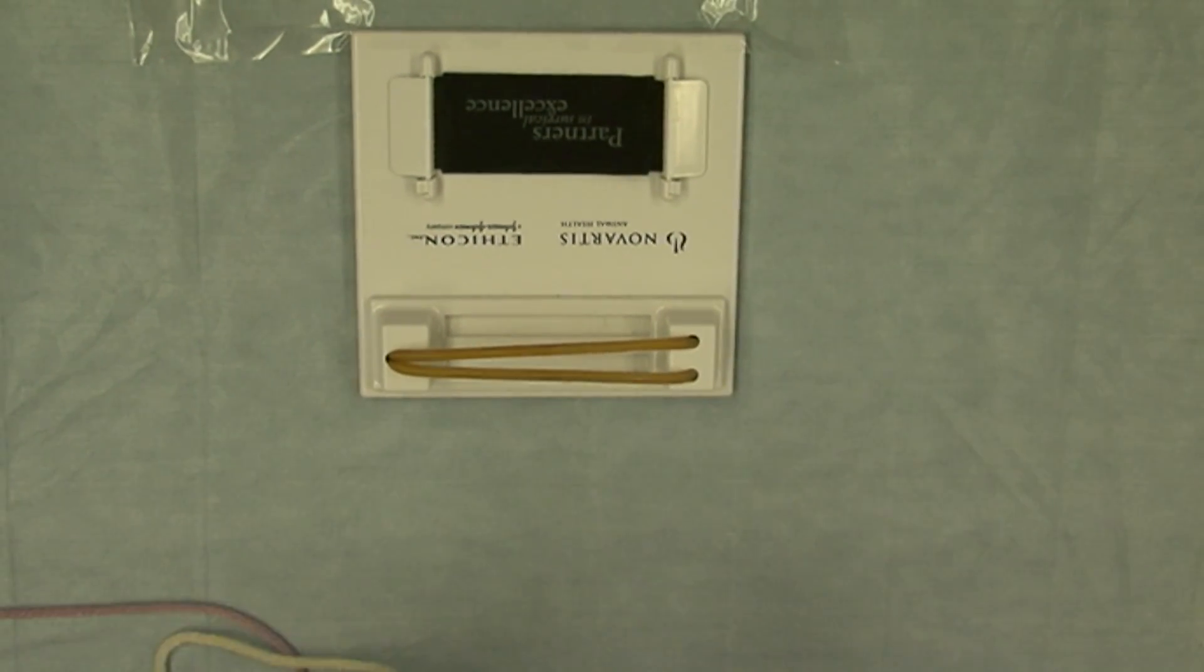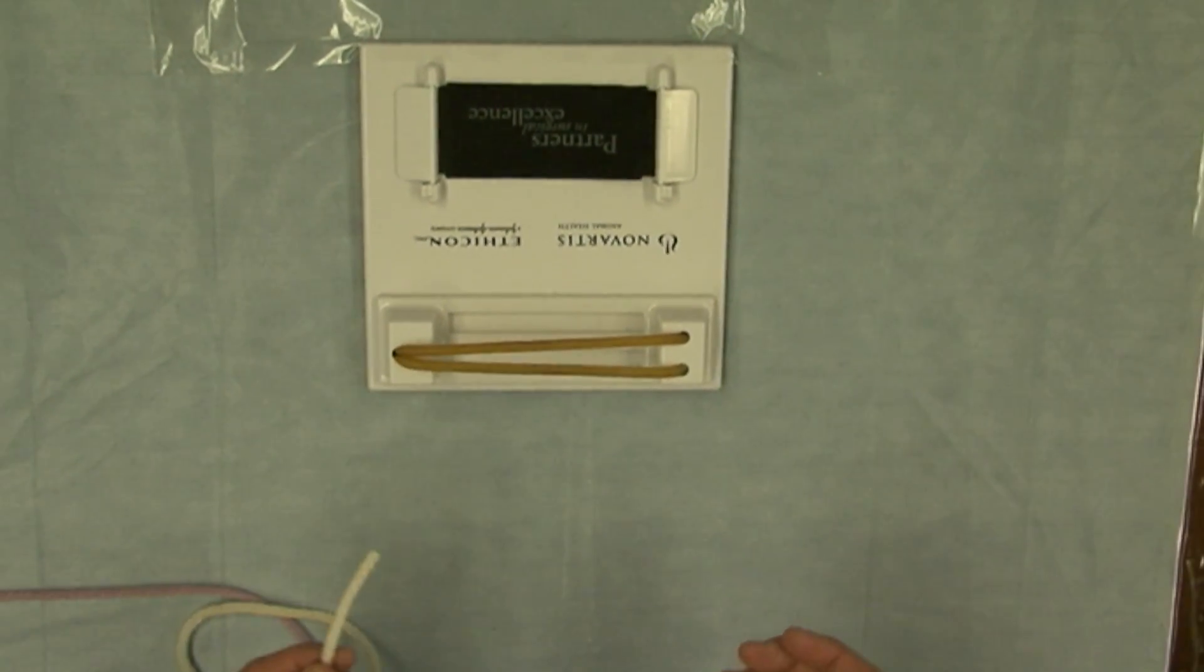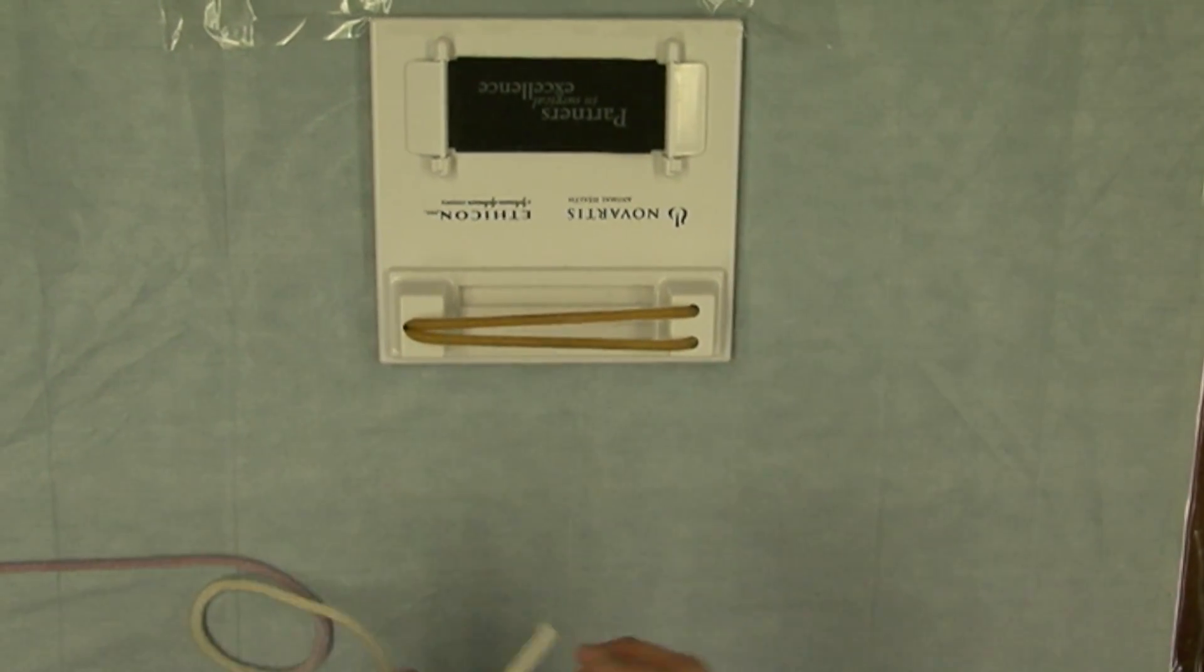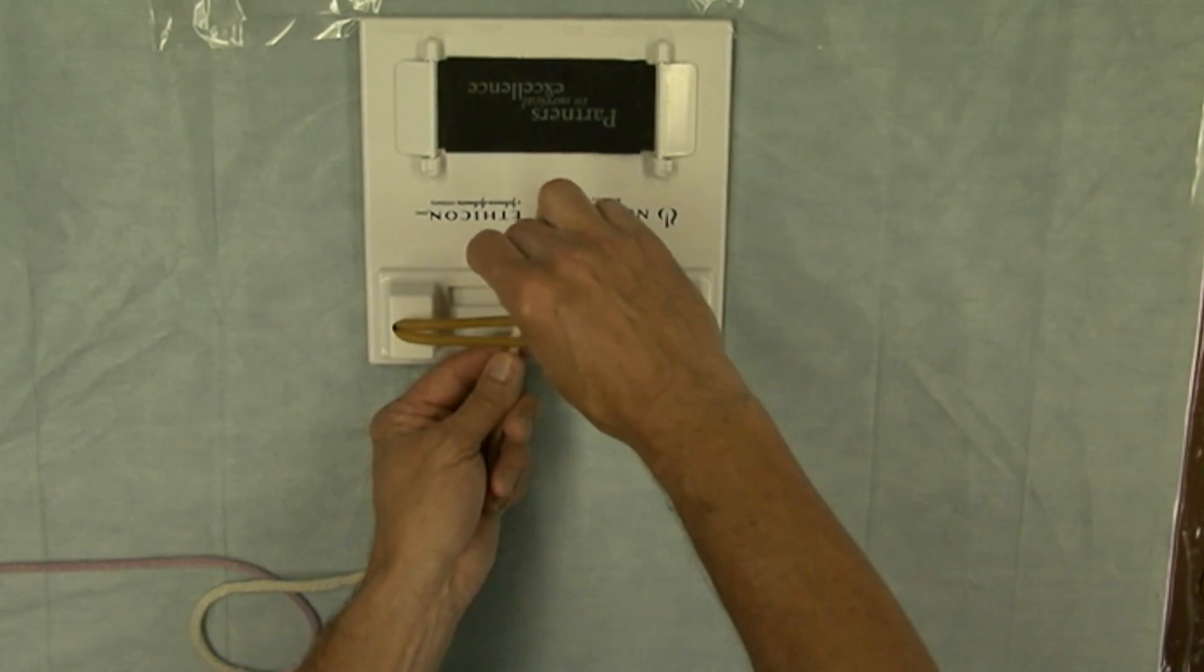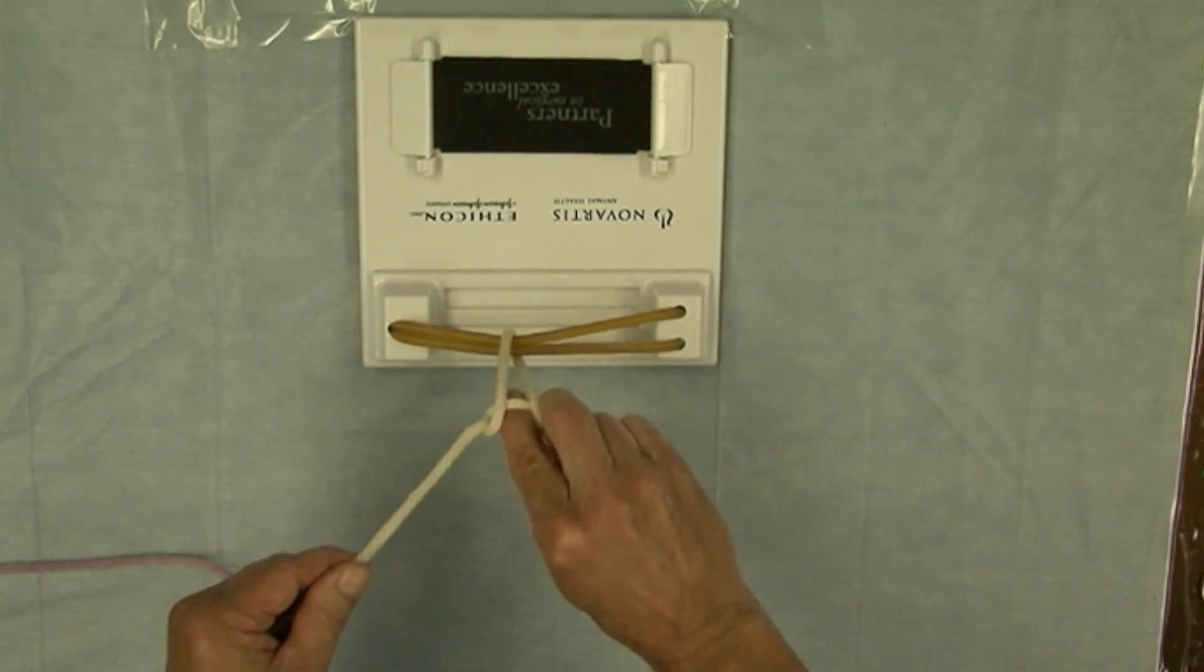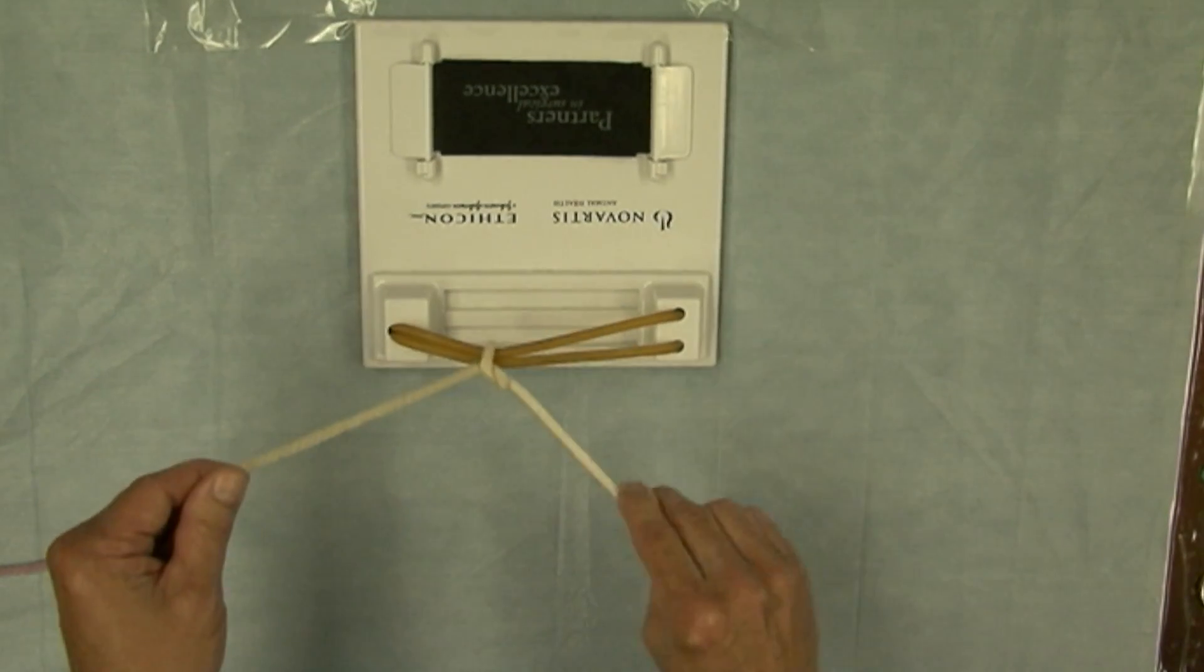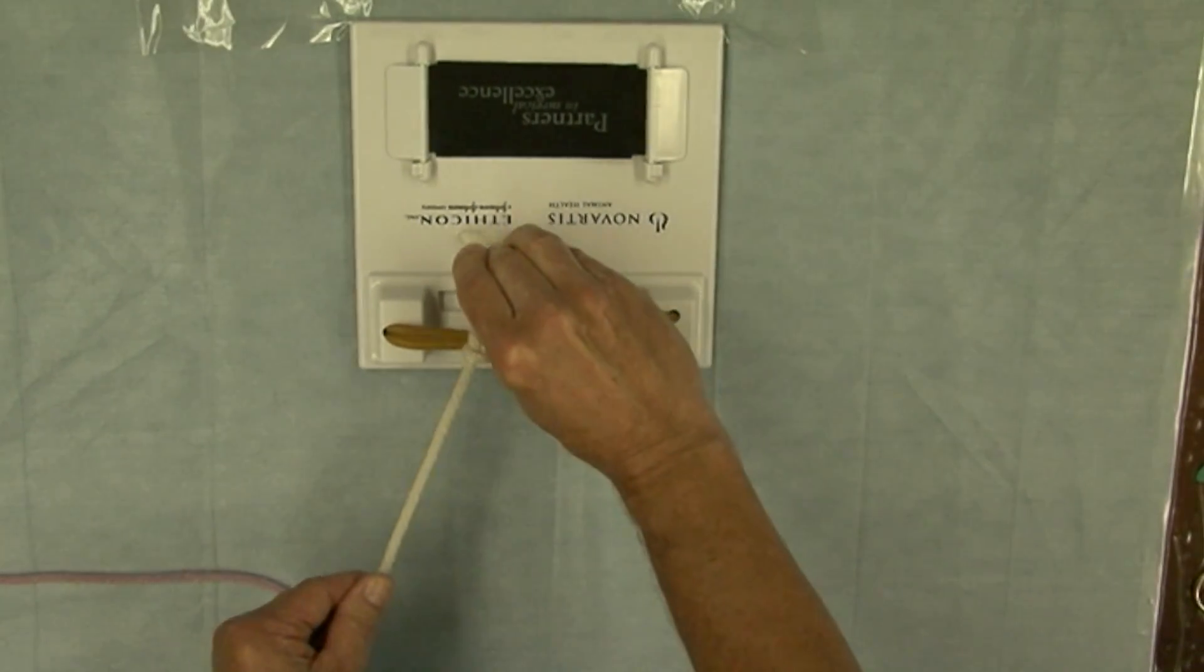There's always a question of why this is called a one hand versus a two hand technique because basically both hands are involved. You'll see as I demonstrate the two hand technique the difference, but let me just show you or demonstrate using one hand only. So this is a one hand square knot using only one hand.